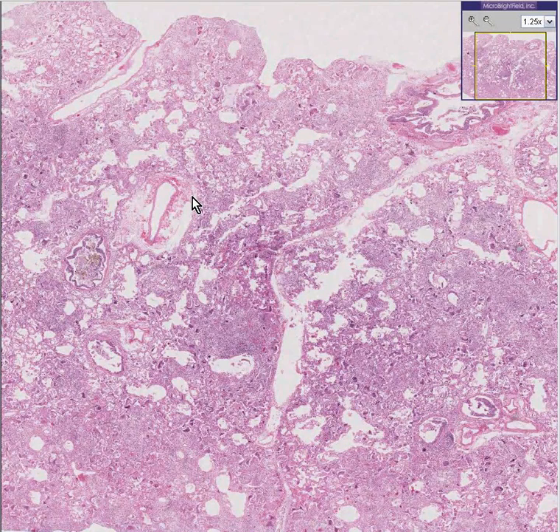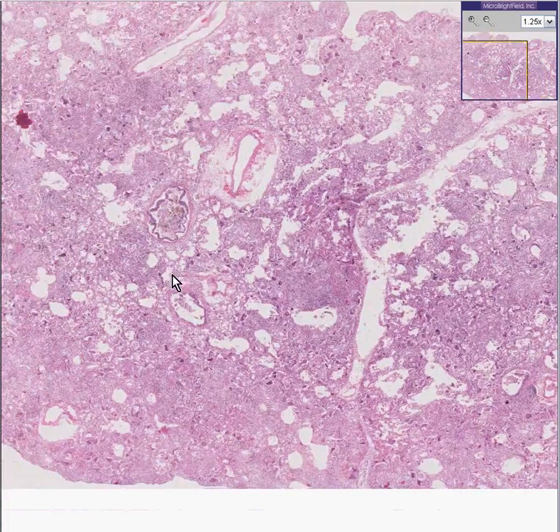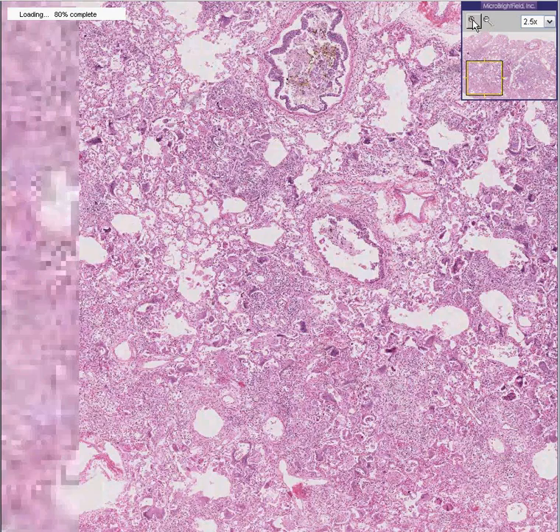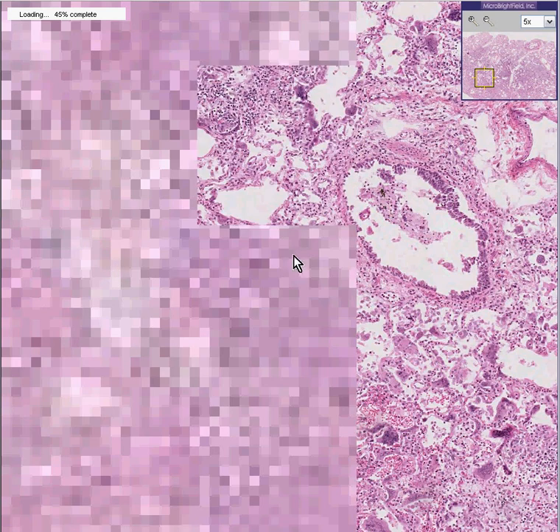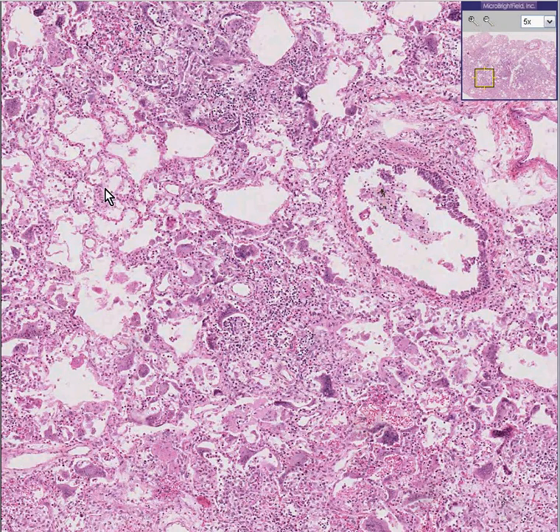Once again, without too much coaxing, I think I could convince you after a couple of clicks that we're dealing with some more lung tissue, because here you could see fairly intact alveoli with alveolar septae.